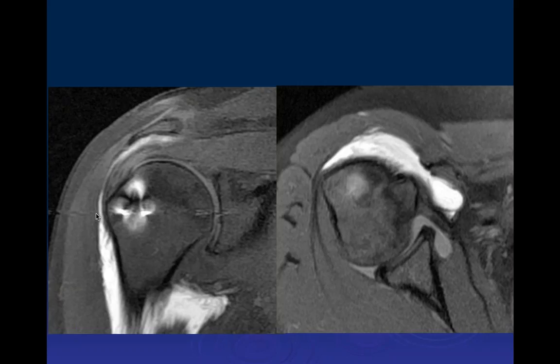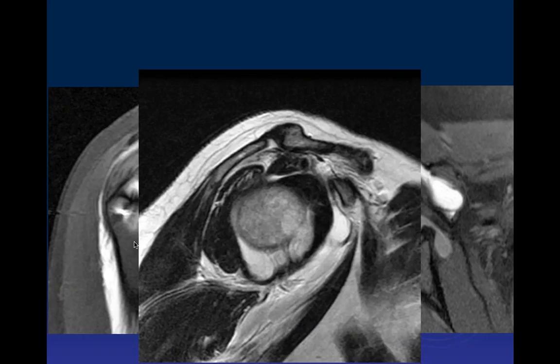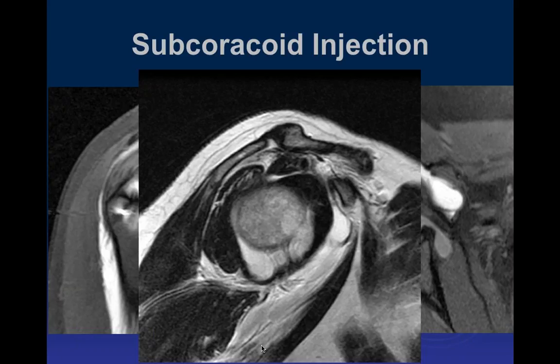And you can see there's previous surgery here with metal artifact in the greater tuberosity. And here we can see the extravasation of contrast out here peripherally. And this was actually a subcoracoid injection of contrast.